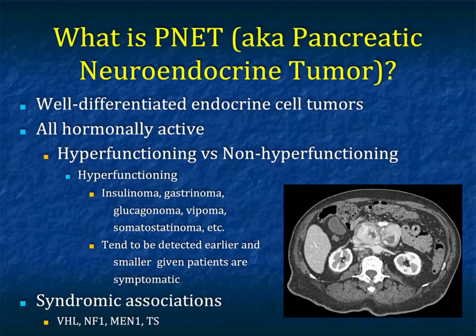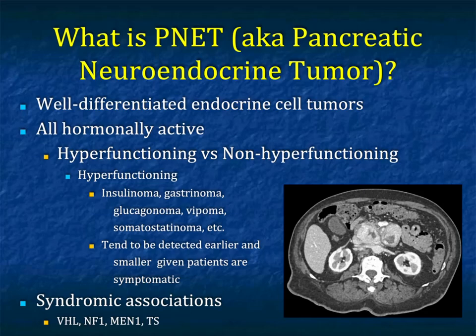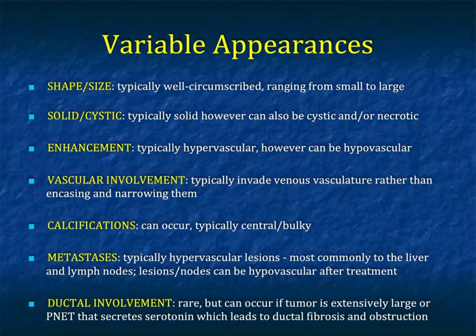The functioning ones tend to be detected earlier and smaller when patients are symptomatic. We do have syndromic associations with Von Hippel-Lindau, neurofibromatosis type 1, MEN1, and tuberous sclerosis. This image shows a large vascular mass in the head of the pancreas and a large secondary nodal component to the left of midline.